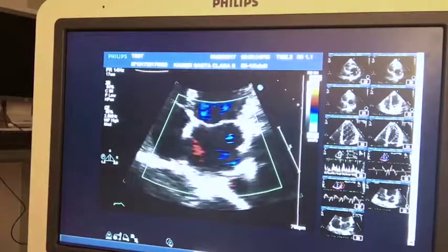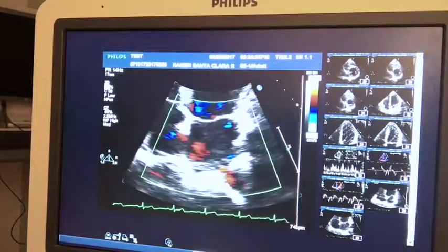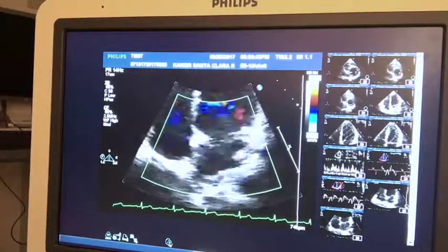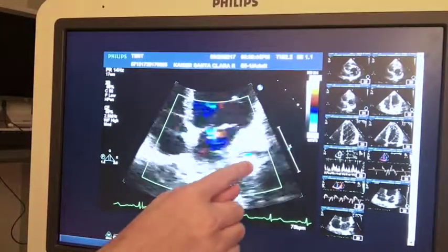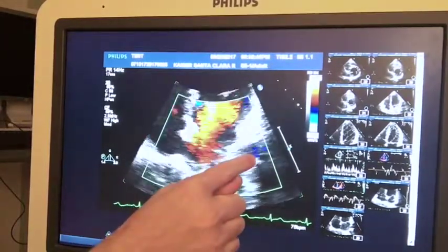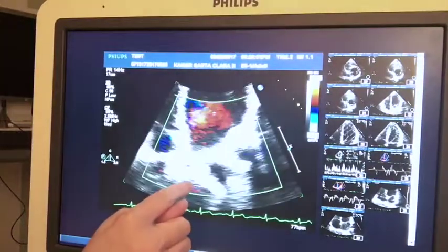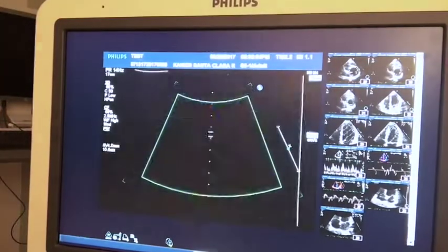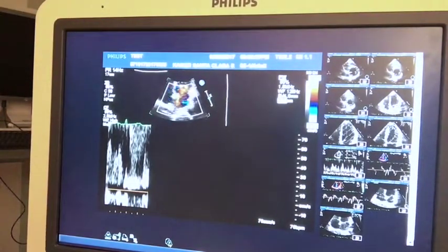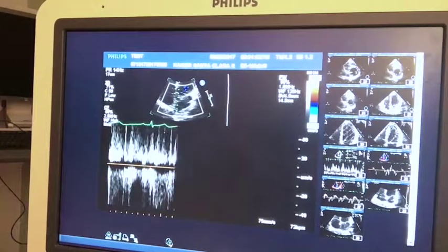So the next thing is I can zoom, and these are maybe extra measurements that aren't always necessary. I can see the pulmonary veins. I can see 3 separate pulmonary veins at least. I can see one there, and I can see one there, and very likely this is one over here, right? So these are all pulmonary veins. If I were asking a question as if this patient were a transplant, they'd received a transplant heart or something along those lines, maybe I'm interested.